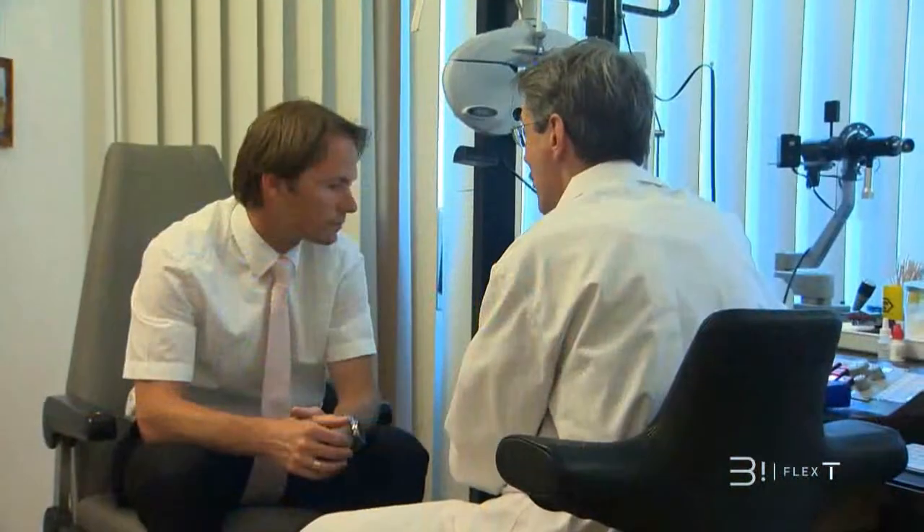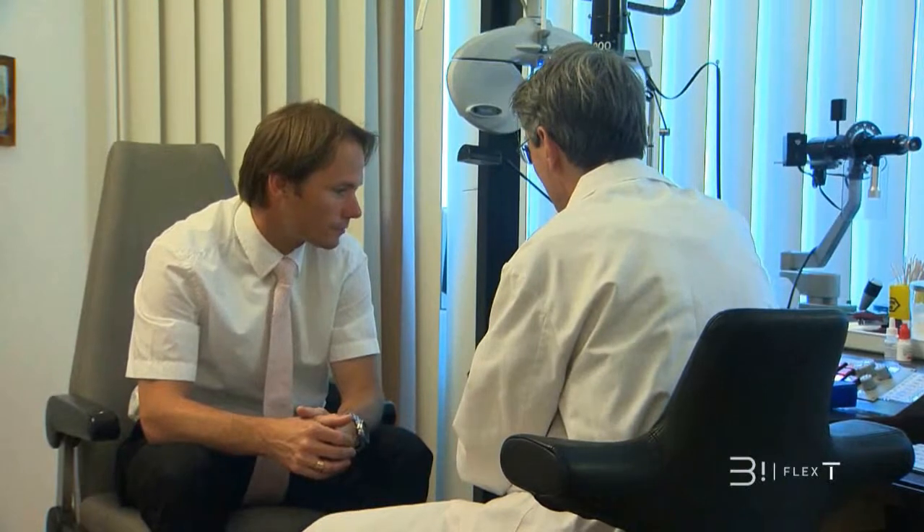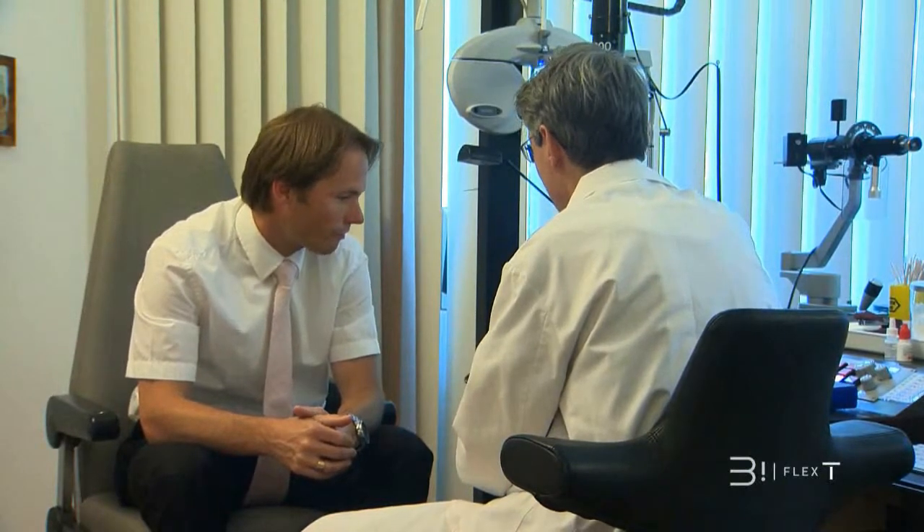During the preoperative interview, it's essential to inform patients about the possibility that the toric lens may not actually be implanted in the required axis, and that they know that in this case it is essential to repeat the operation subsequently and put the lens into the right position in relation to the appropriate axis. If patients are informed that this might happen, there's no difficulty in doing it.